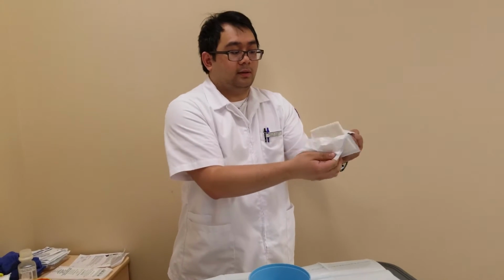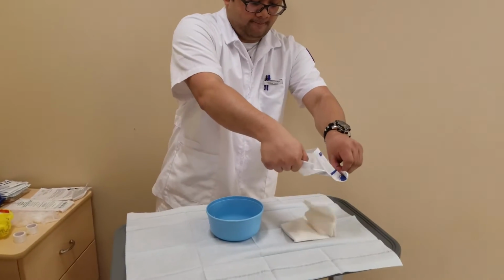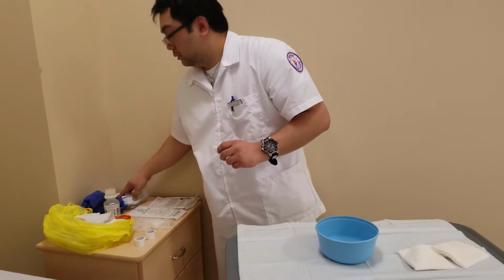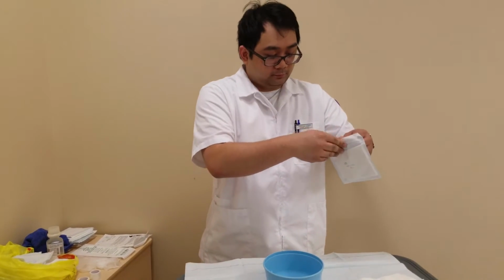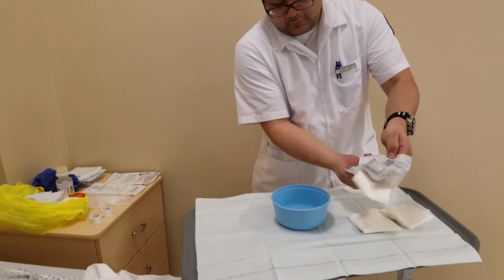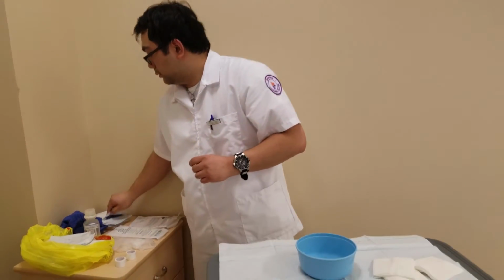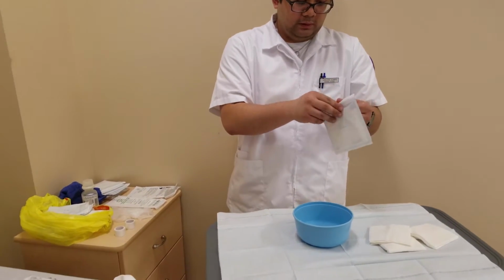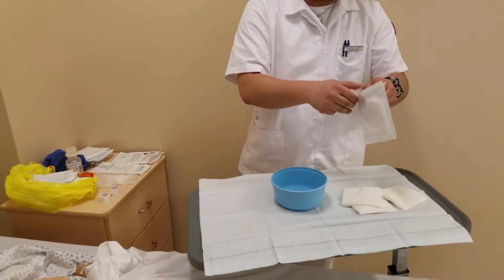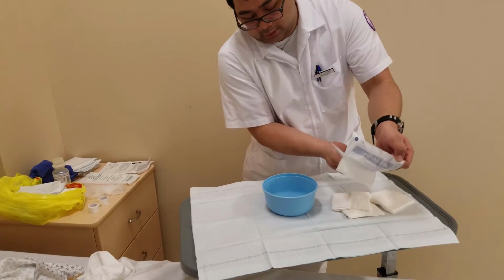Once again, because this is sterile inside, you don't want to touch it with your bare hands. Now, of course, you don't want to tear right through the packaging, because that's how you ruin the sterility of the gauze.